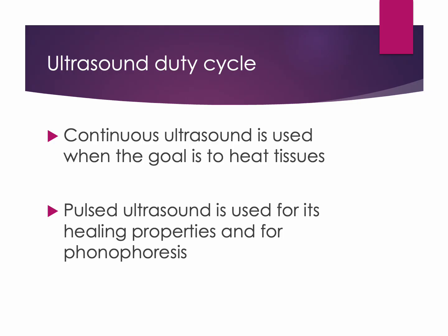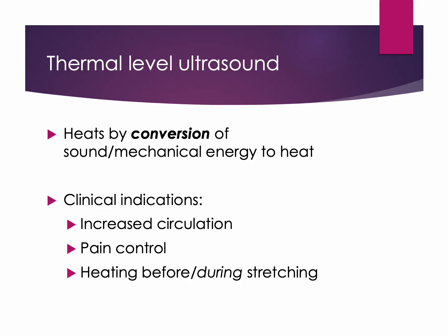Continuous ultrasound is used when the goal is tissue heating. Pulsed ultrasound is used when the goal is tissue healing or drug delivery through phonophoresis. Thermal ultrasound increases tissue temperature, which can improve circulation, reduce pain, and prepare collagenous tissues for stretching.